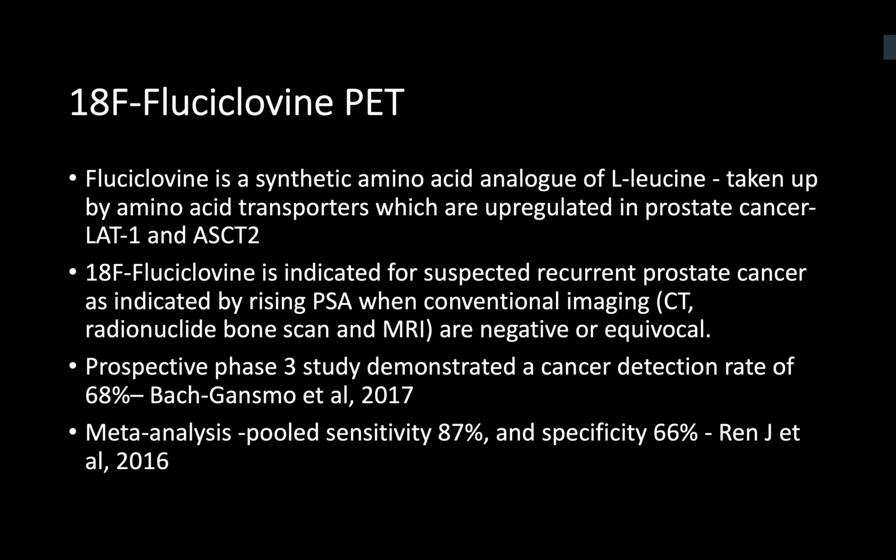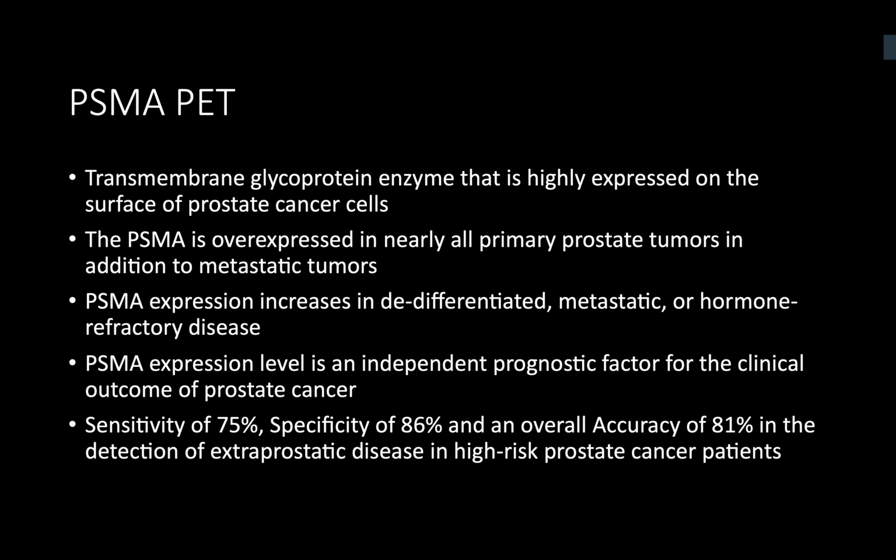And then what happened was that the PSMA PET came in. So you have to know about the PSMA PET, because that is the approved one according to EAU guidelines. The others are approved by the FDA. The Fluciclovine is approved by the FDA.